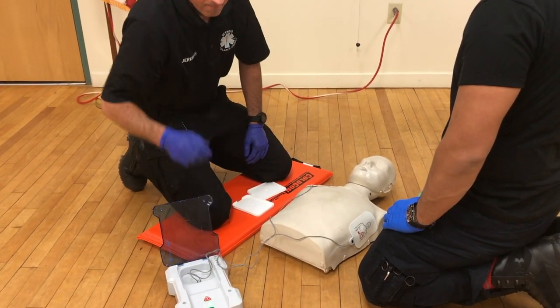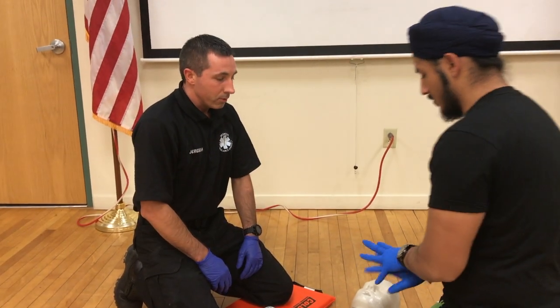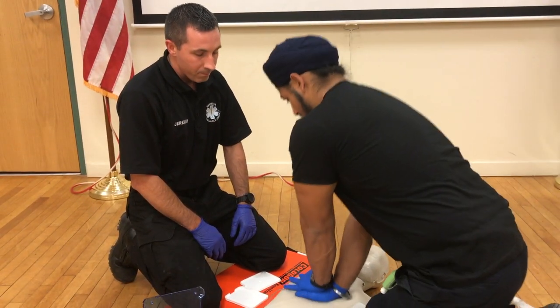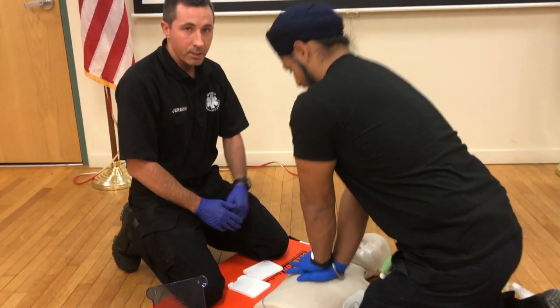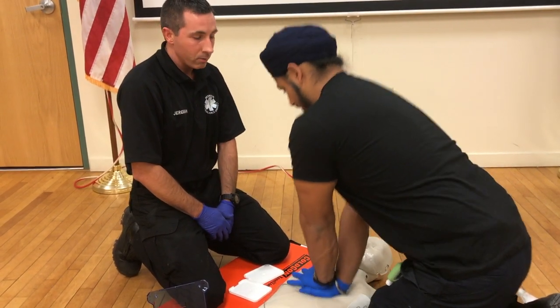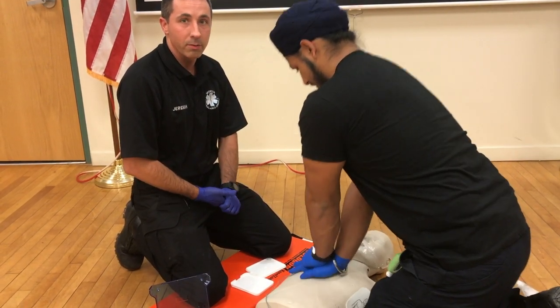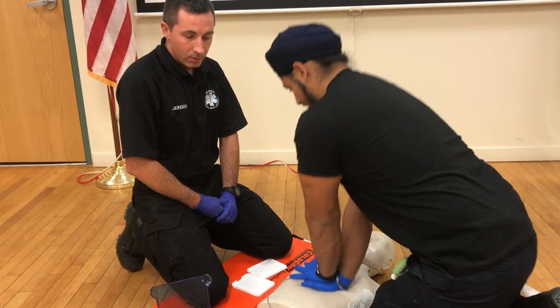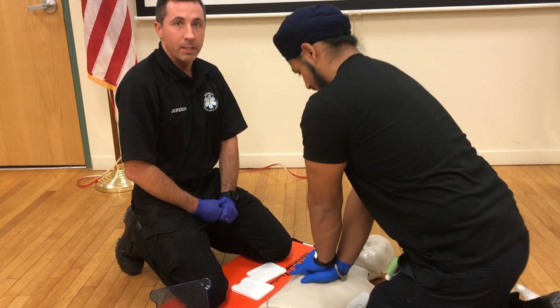Shock delivered. I'm now going to ask my partner to resume compressions. At this point we would continue CPR. We would also load our patient for transport to the hospital. And at this point, I'm done with the station.